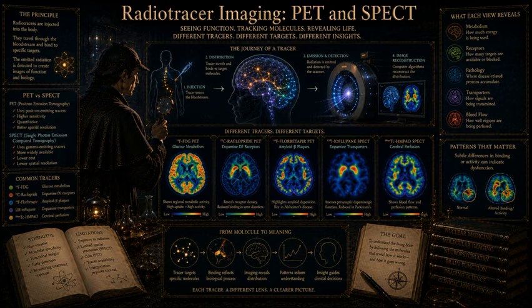That single electron is pulled violently toward a metal plate inside the tube called a dynode, which is held at a high positive voltage. When the electron slams into the dynode, the impact knocks 3 or 4 more electrons loose. Like a bowling ball hitting pins. Exactly. And then those 4 electrons are pulled toward a second dynode at an even higher voltage. They slam into it, knocking 16 electrons loose.